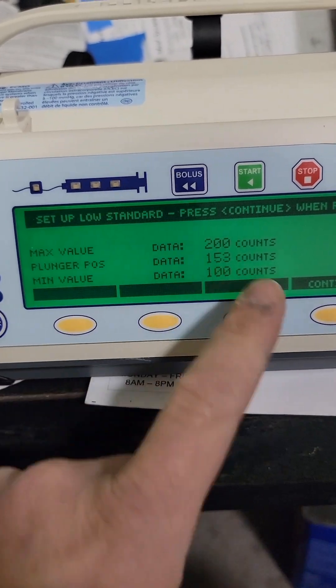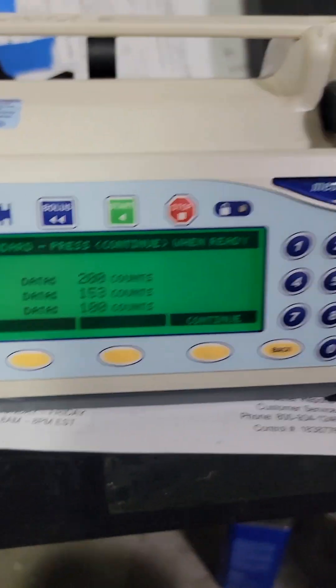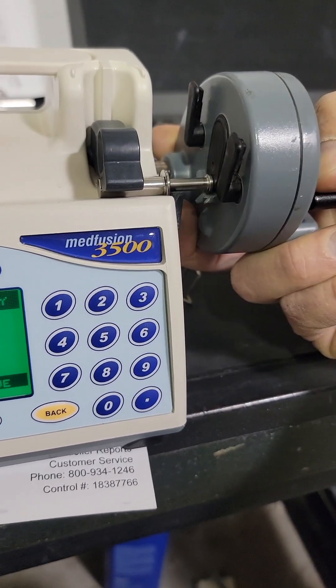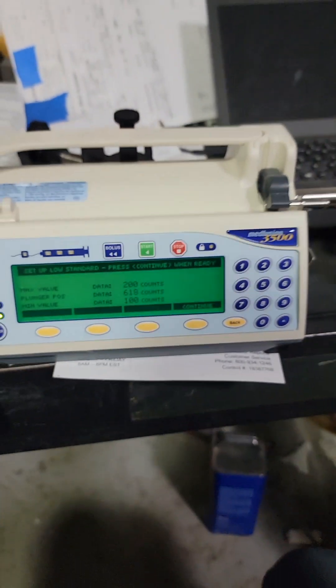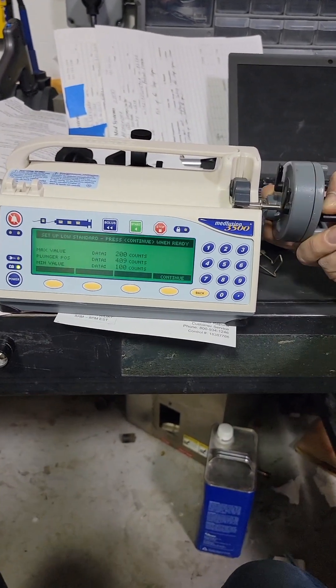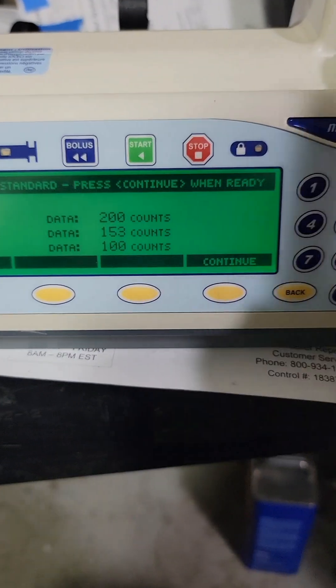Now we are in plunger position, which is the other part of this — where this one is here. I move that back and forth a few times — see your number changes. Put it on there — 53. Press continue again, and now the low is done. Now we're going to move to the high, which means the next calibration slug.